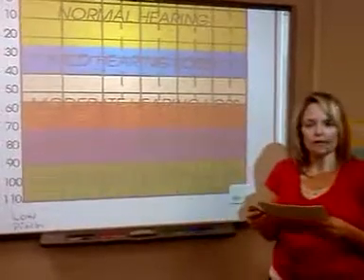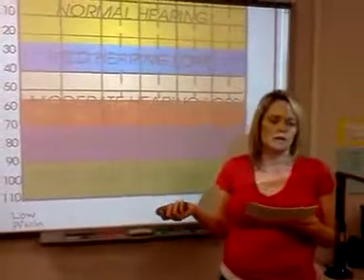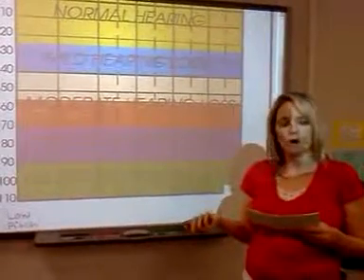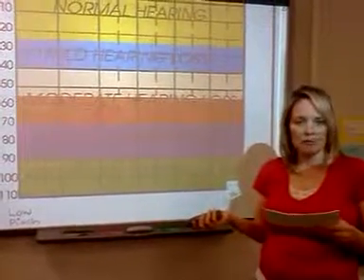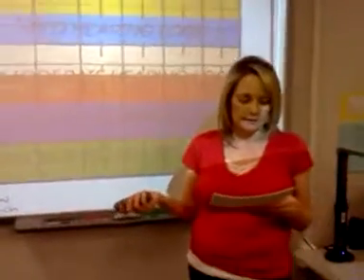Third, we want to consider the shape of your child's hearing loss across frequencies, or tones, of the audiogram. For example, it is important to consider if both ears are involved in the same way, and if the hearing loss slopes toward lower or higher frequencies.